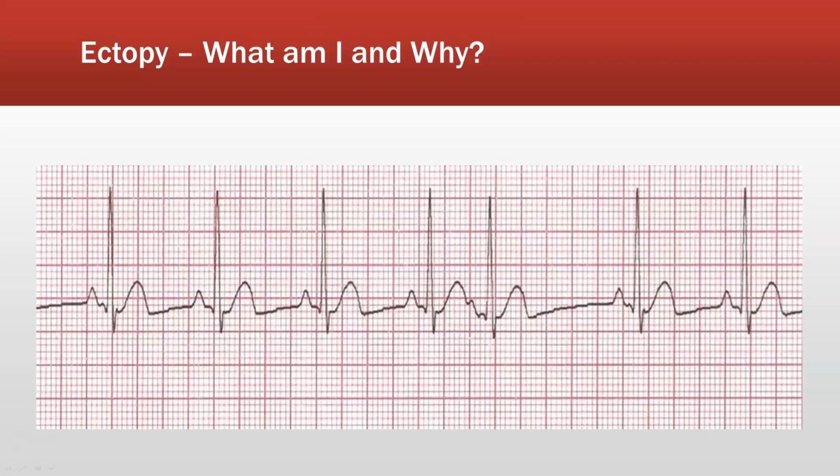So, just looking from a, hey, this is on the exam, standpoint: if I put this on the exam and it said, how should the nurse document this rhythm, it is an underlying rhythm because I only have one ectopic beat. One thing came early, it's skinny. I would call this a sinus rhythm with PAC. Again, I'm not doing a whole lot. I'm not running down the hall, but I will go and check their MAR, check their electrolytes. I can check their SpO2 and make sure that we're not having runs of PACs.